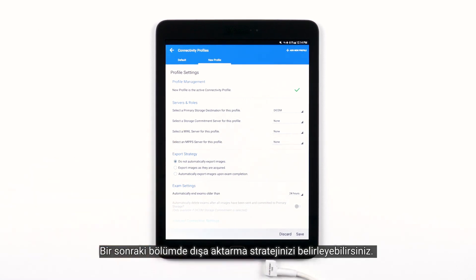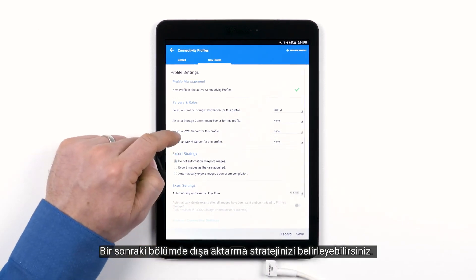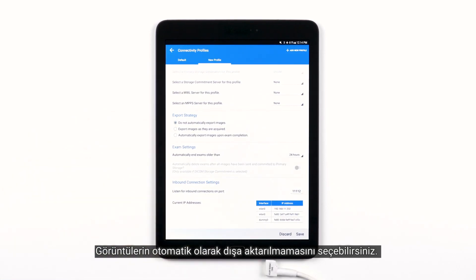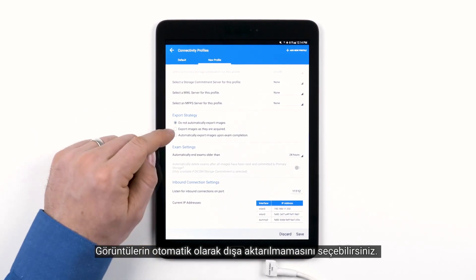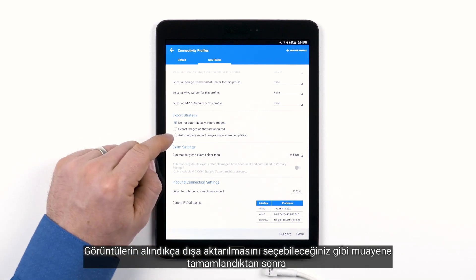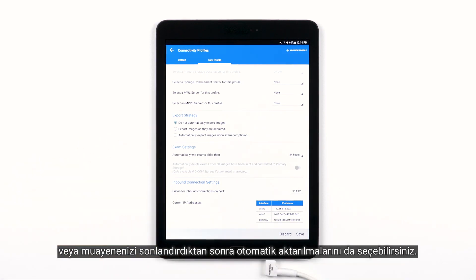The next section is where you set your export strategy. You can choose to not have images automatically exported, you can choose to export images as they are acquired, or you can set it up to automatically export images upon exam completion or once you've ended your exam.